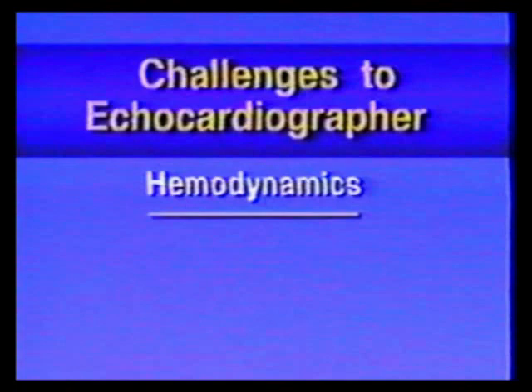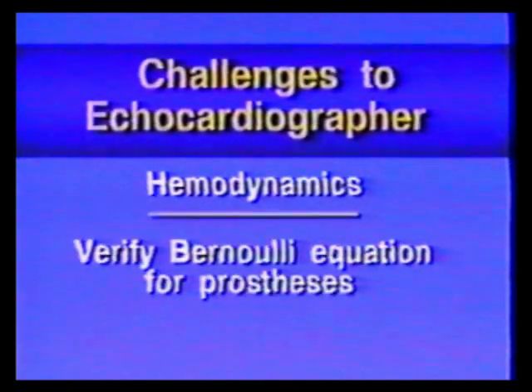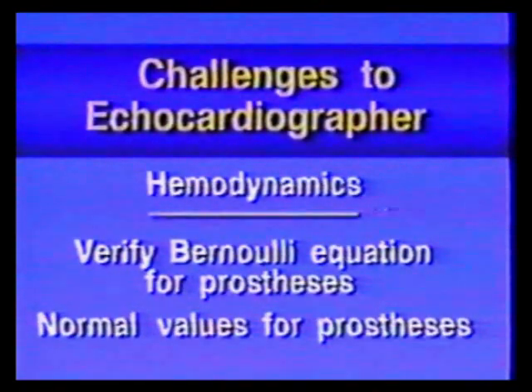From a hemodynamic standpoint, it is necessary to establish whether or not the simplified Bernoulli equation can be applied to prosthetic valve gradients, and it is necessary to establish normal values for the many different types and sizes of prostheses.